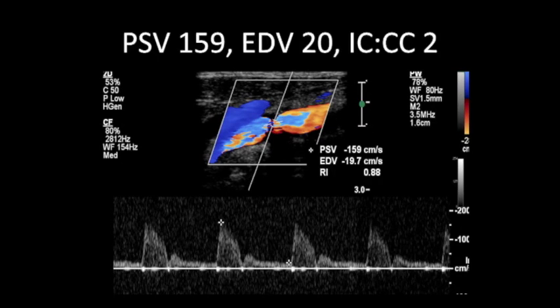So we did this, and they actually found a peak systolic velocity of 159. There is not a lot of diastolic flow here. This is a patient who had other cardiac issues, John. That was a good pickup, but I'll show this another year for heart problems. But the ratio turned out to be 2, and we confidently made this a diagnosis of 50 to 69%.